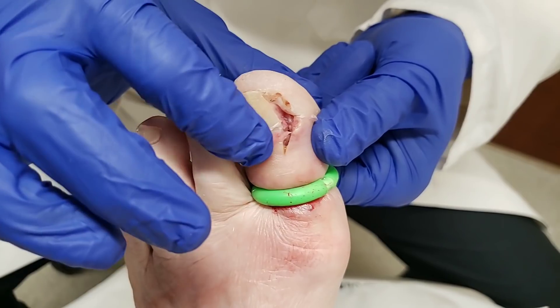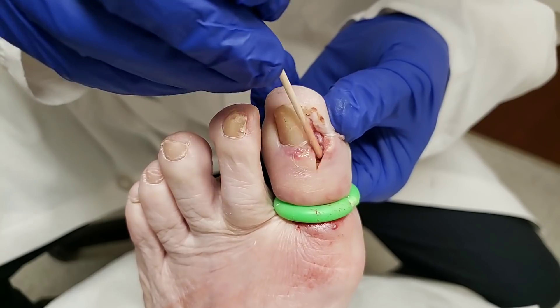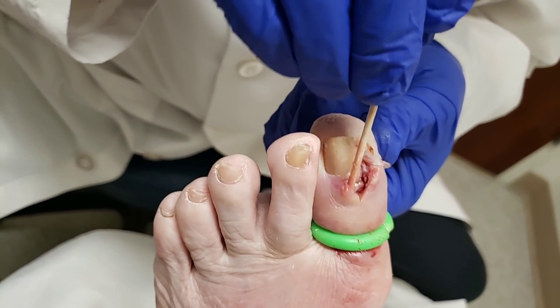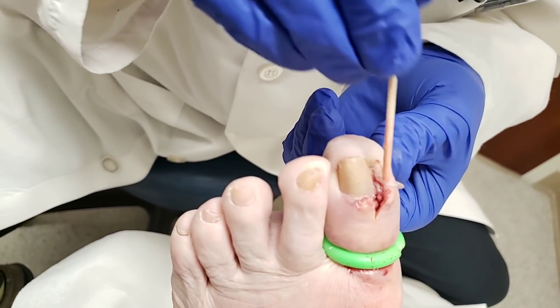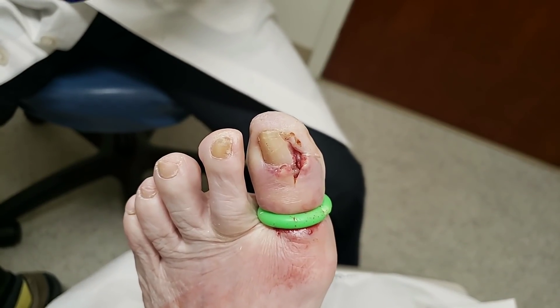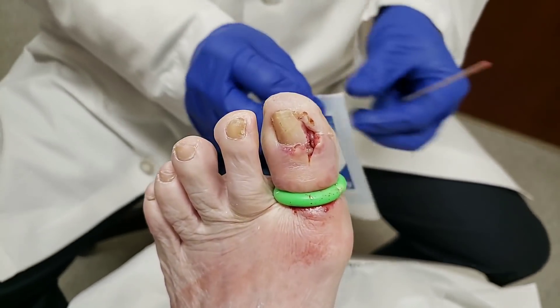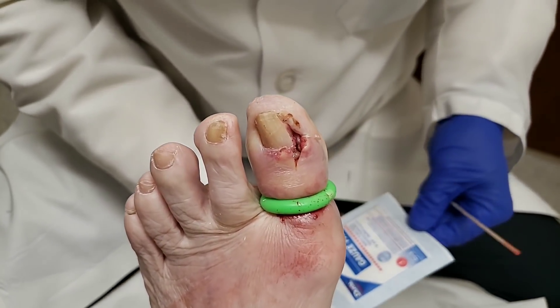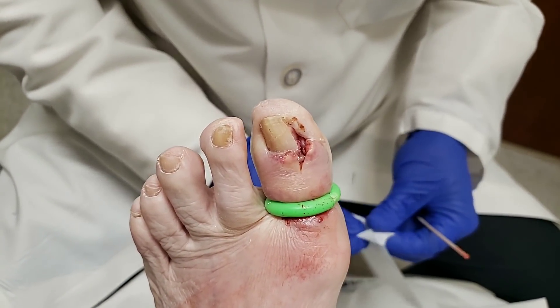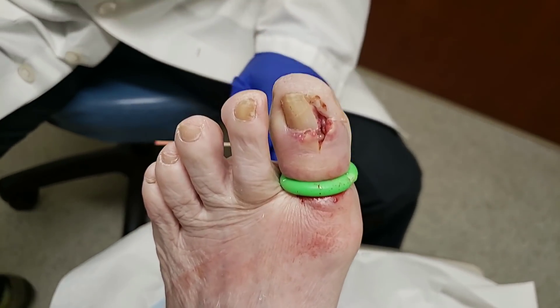Now we have this incision here and the area that's been opened up, and I think we've opened it enough. I can see it's all open in there on the sides. Now we get a little bit of sterile gauze — there is enough liquid and drainage right in there.